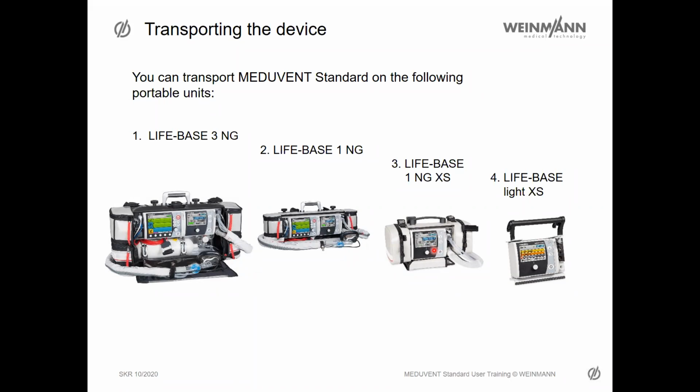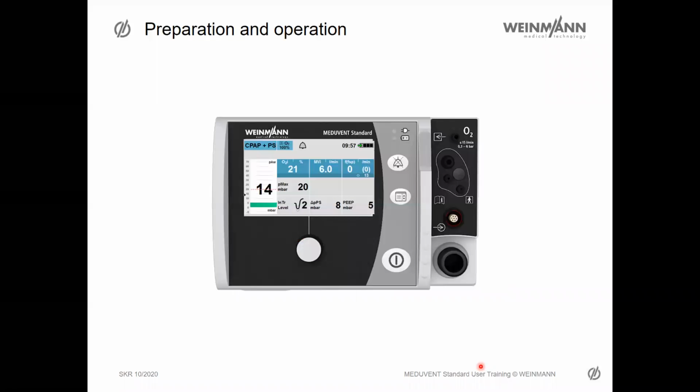These are possibilities only for MEDUVENT standard. They are very small, very lightweight. So that's what the customer has to choose on the portable unit side.